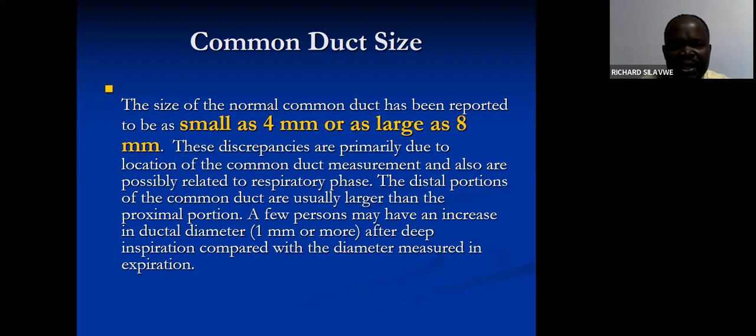by a simple millimeter. So you should not be surprised to find, for example, in a 70-year-old patient, a common bile duct measuring 9 millimeters. You should consider that it could be a normal thing at such ages.